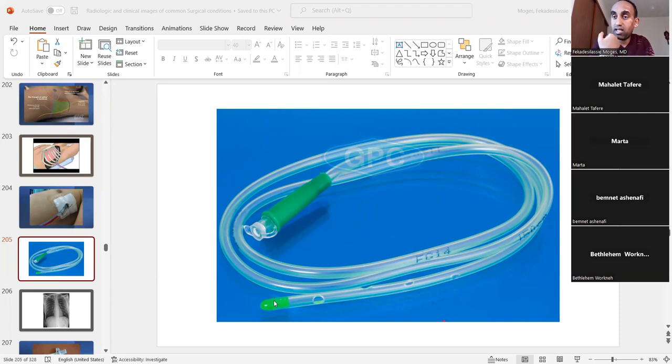It has to glide, right? So it's gliding through the nose, so it's not catching any tissue. So it has to glide smoothly, so the tip is blunted, but it has multiple holes, you see? So for the NG tube, there are many indications. Read about indications for NG tube insertion. And one of the reasons is just to evacuate content, right?